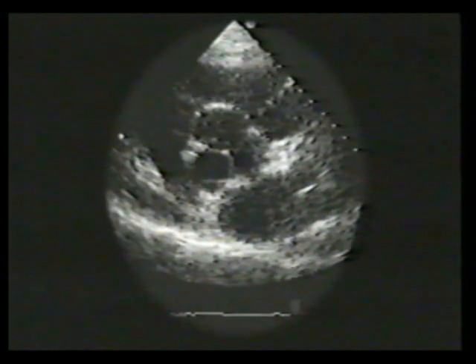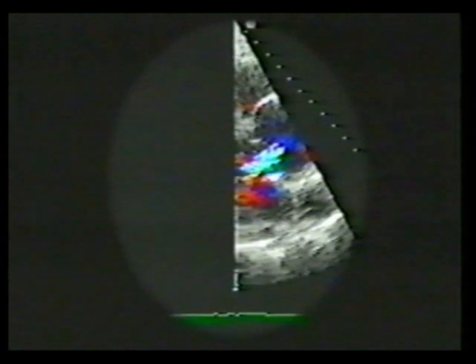In short axis, mild enlargement of all three sinuses is evident. Any process which enlarges the aortic sinuses and annulus can result in aortic regurgitation. Returning to parasternal long axis format, we see that this patient has moderate aortic regurgitation, secondary to his ectatic aortic root.